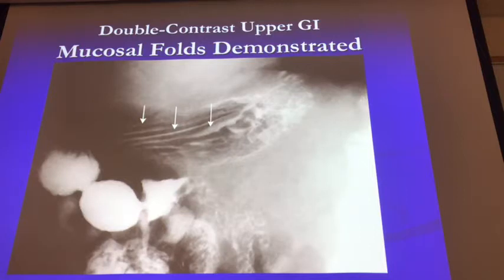Okay, or what we used to do, there were a couple of radiologists, they will put a needle in the straw. And so when the patient swallows the barium, they are also swallowing air. So that's one way of doing it too. But the most common nowadays, and it's the easiest thing, is to just give a sparkle. So you have the patient put them in the back of the throat, swallow it with a little bit of water, and then they expand in the stomach. You don't want them to expand in their mouth. Then they're going to start.